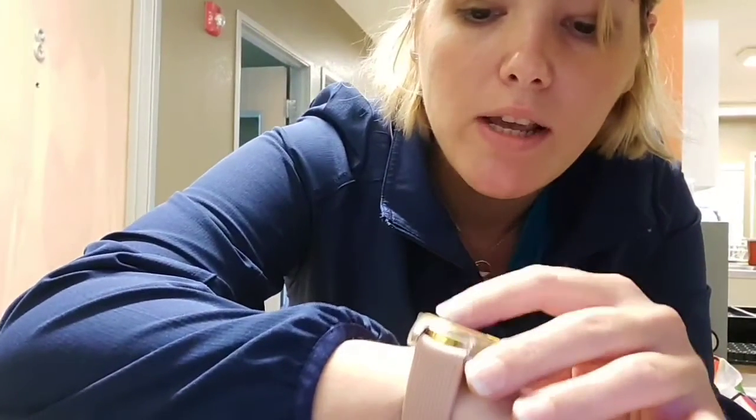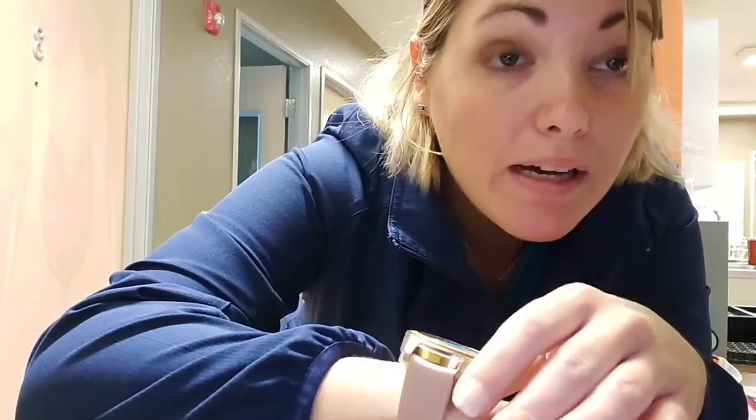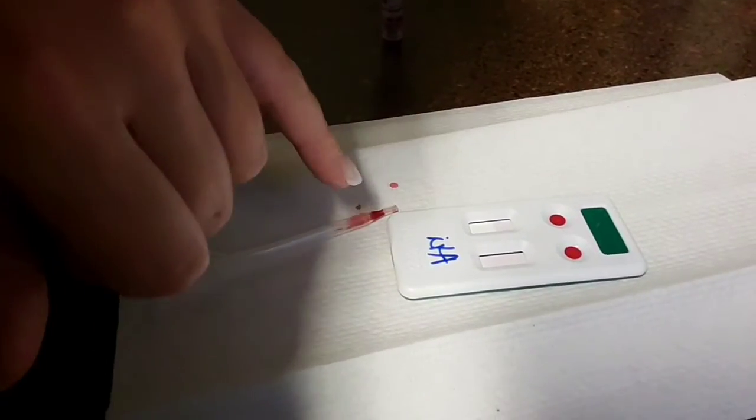And then we just let that wick on down. We do set our timer for 10 minutes. After 10 minutes has completed, which I am going to set here on my watch, we will come back, and that's when we can take a look at our results on whether or not our kitty is positive for FeLV or FIV. I will let you see the wicking process here real quick as it's coming down, so you can see that it is moving. And then we'll read that here in about another 10 minutes.